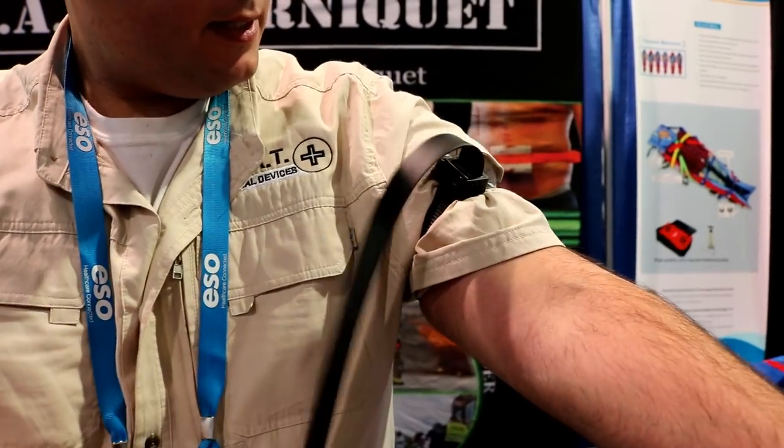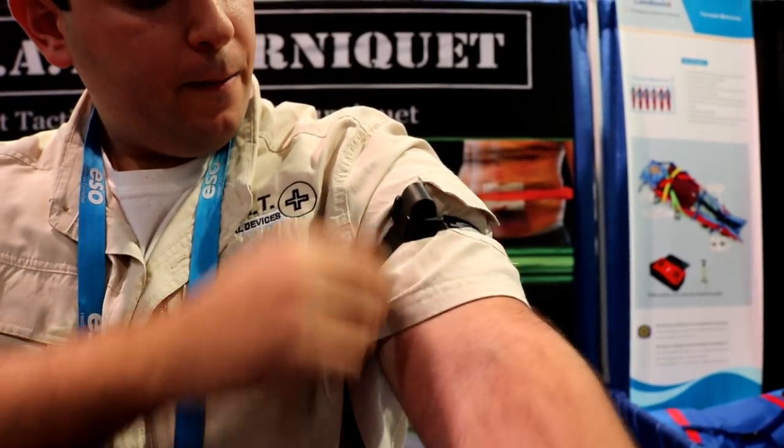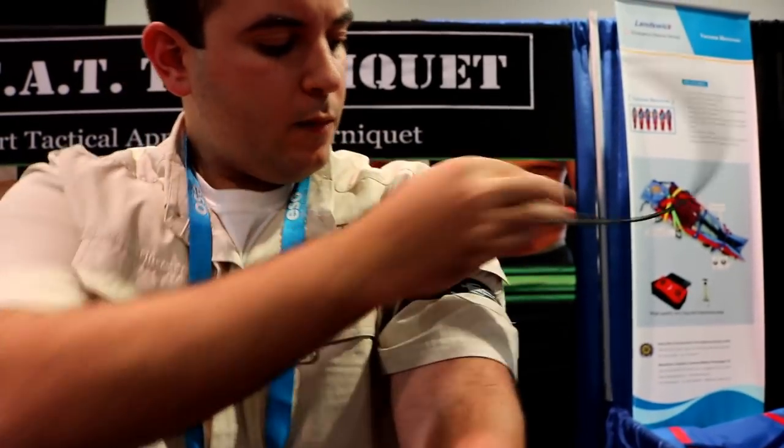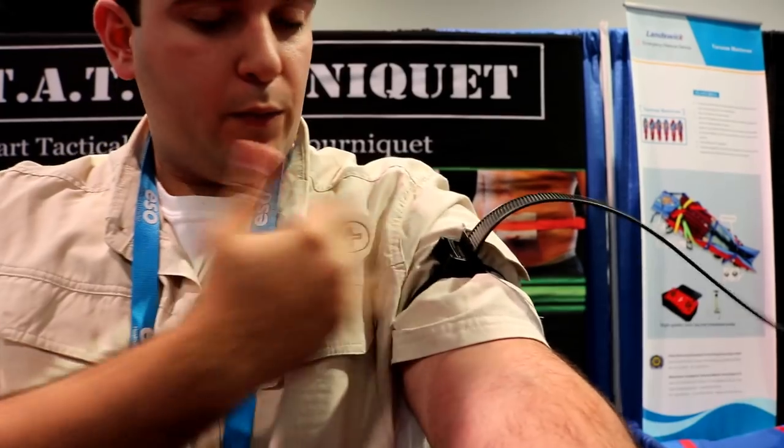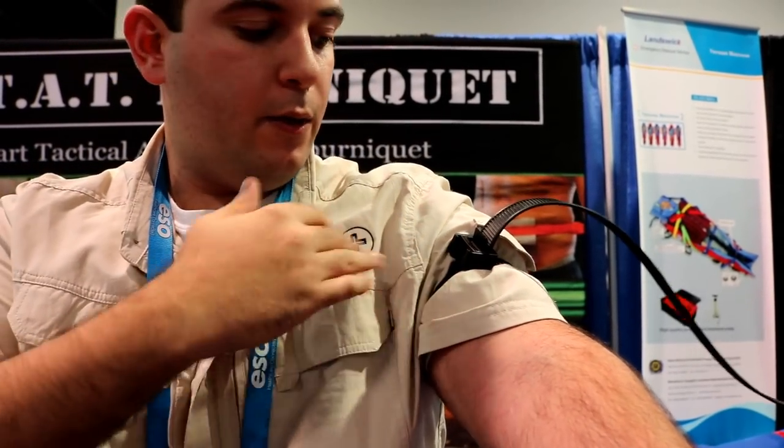Right here is a tail holder that you can put the strap through to cover the safety release lever. This is very difficult to just release on its own. It has three locking systems in here, so you don't have to worry about that.